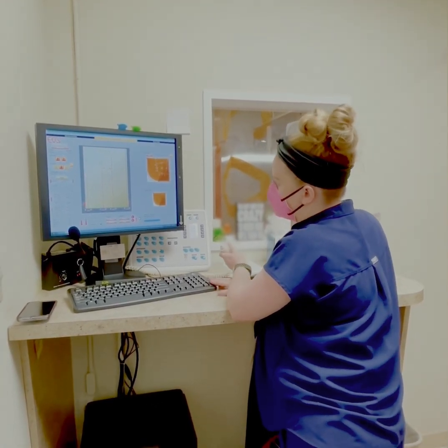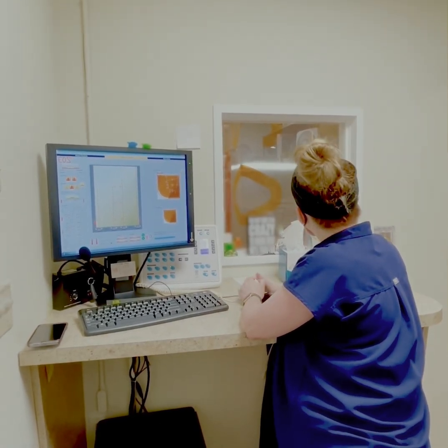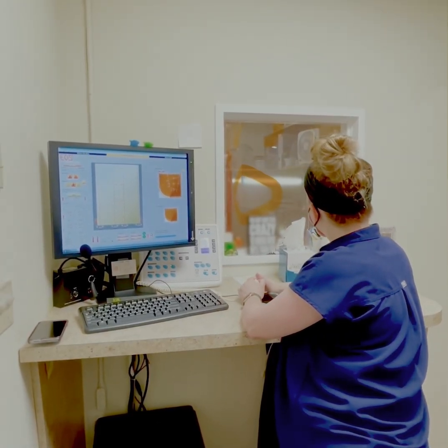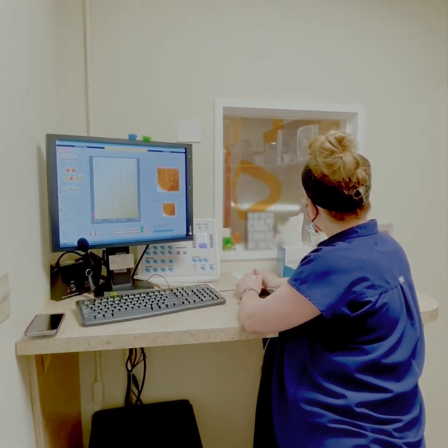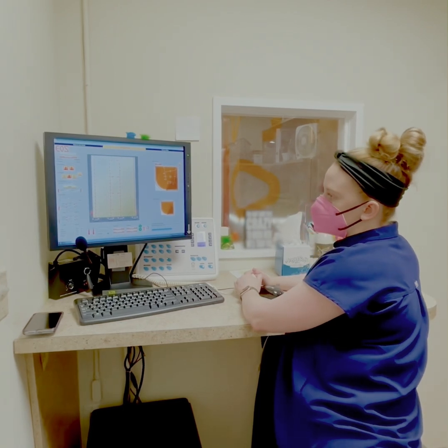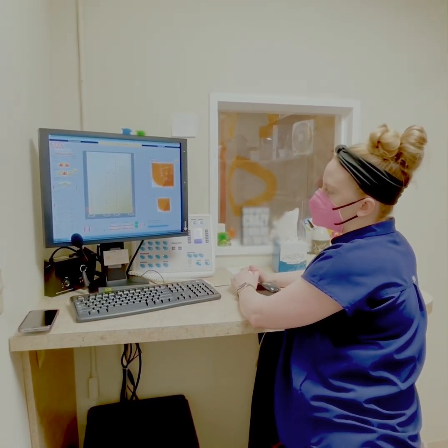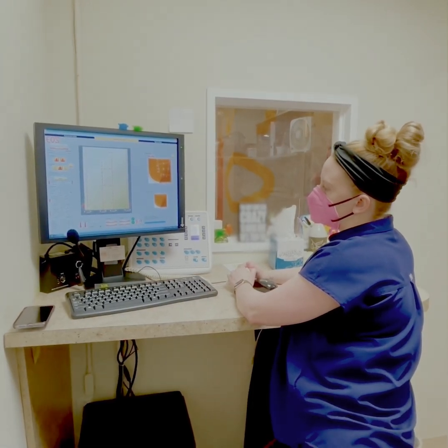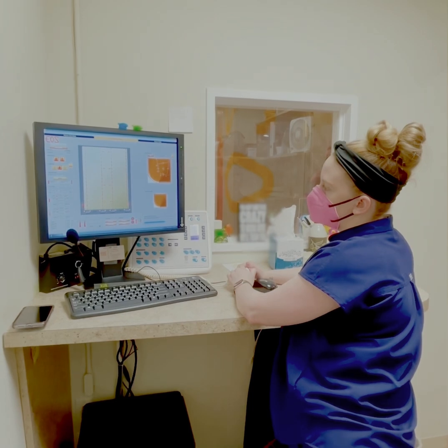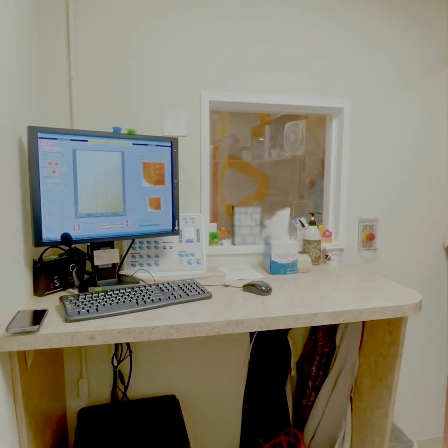And then you can see the white lines over here, and that's where the x-ray beam is going to be coming. And you can see how it scans linearly going from the top to the bottom of the patient's body, all controlled by a computer. And now you'll see in just a moment, after what we call acquisition, where we get the information, the images of the spine will be coming up.